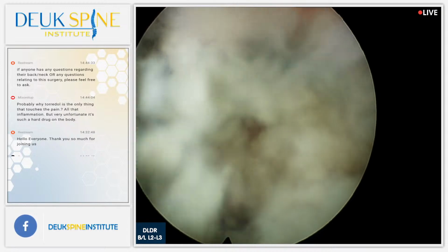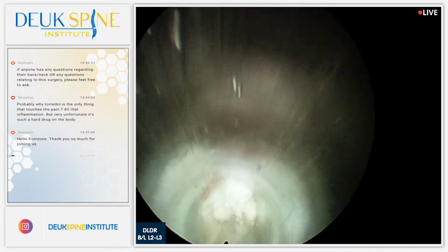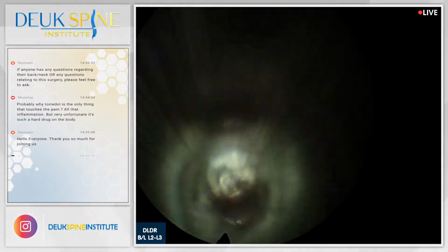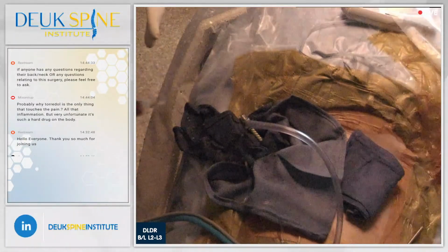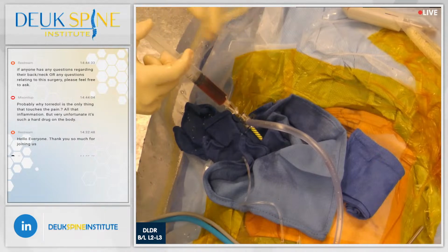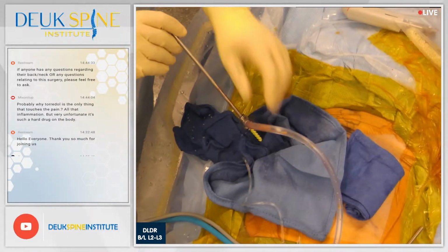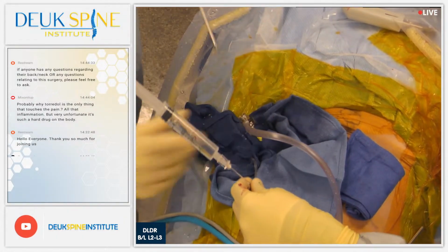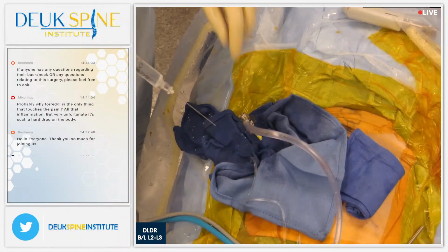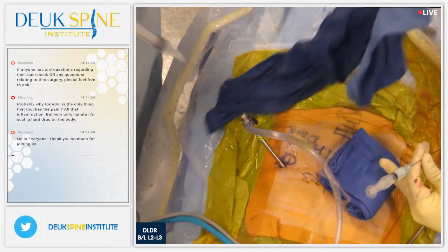All right, we're done. I'm happy with this. He should have some really good relief of his pain, but he's still going to have the facet pain until we fix that. And the facet pain is happening where his artificial discs were put in. Common problem with artificial disc is facet pain. Look it up. Happens all the time. It's probably one of the number one reasons for failure of artificial discs.